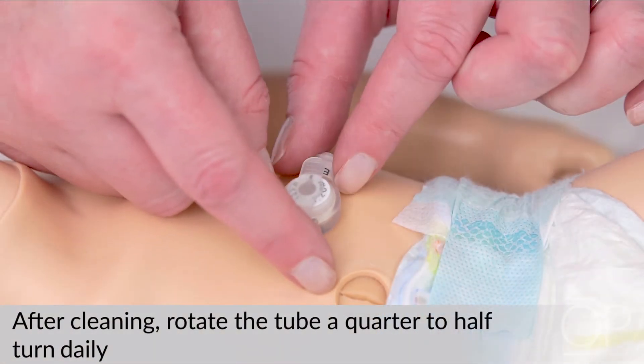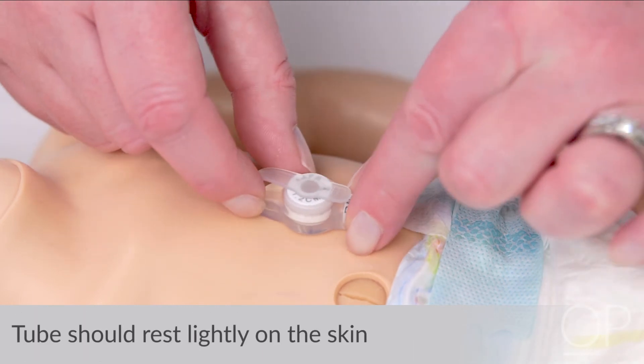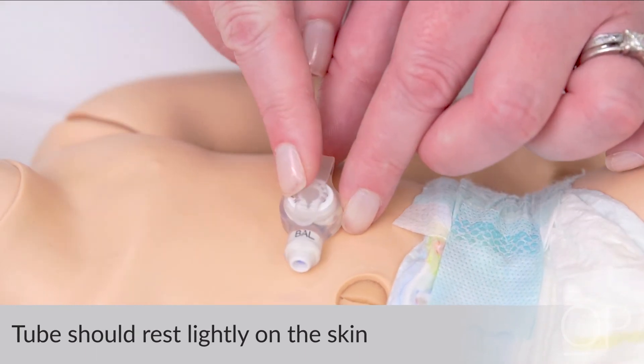After the site is cleaned, rotate the tube a quarter turn daily to prevent skin irritation from the tube staying in the same position. Make sure the tube rests lightly on the skin surface or dressing. There should be a thin, dime-sized space between the tube and the surface of the skin or dressing.